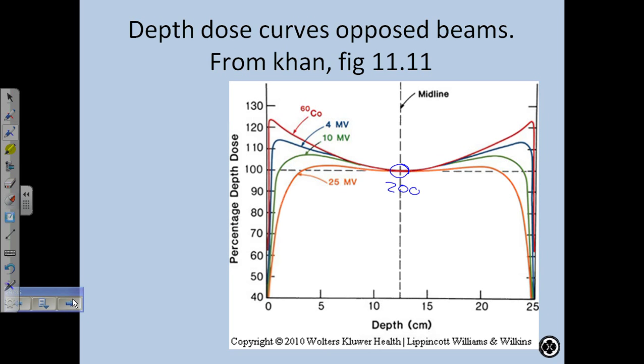Now that may or may not be an issue. If you're treating pelvis, maybe it's not that big a deal. But say you're treating head and neck, where you're trying to spare carotids, that could be an issue. Okay. And actually, head and neck is not a good example because the separation is so small. So that effect might not be as pronounced. We shrink this down.